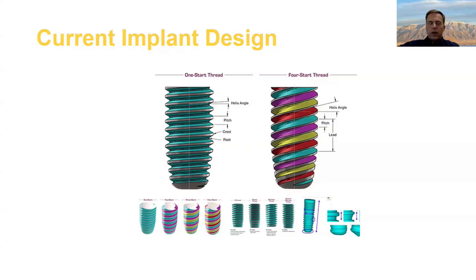So that's really important. Last but not least, I'm sure most of you know that when you're placing an implant, you want to get primary stability. When it's placed, it's like a wood screw. Obviously, over time, it's stabilized by the bone that adheres to it. But for that to occur, the implant has to have less than 150 microns of movement in any direction during the healing. And so the shorthand way of checking that is that you have at least 35 Newton centimeters of insertion torque or a minimum ISQ score of 55 on the day of surgery.